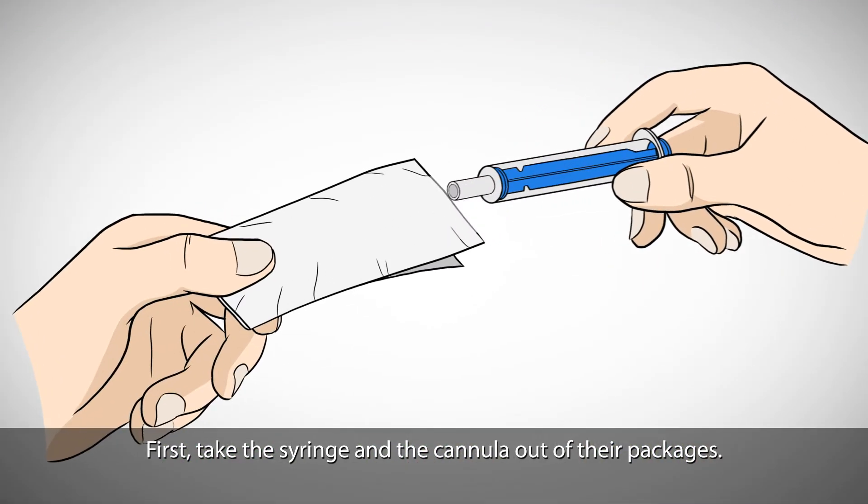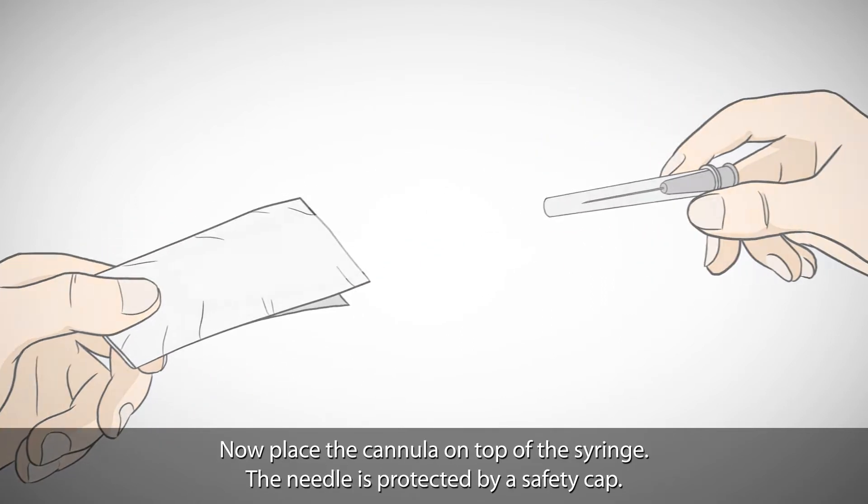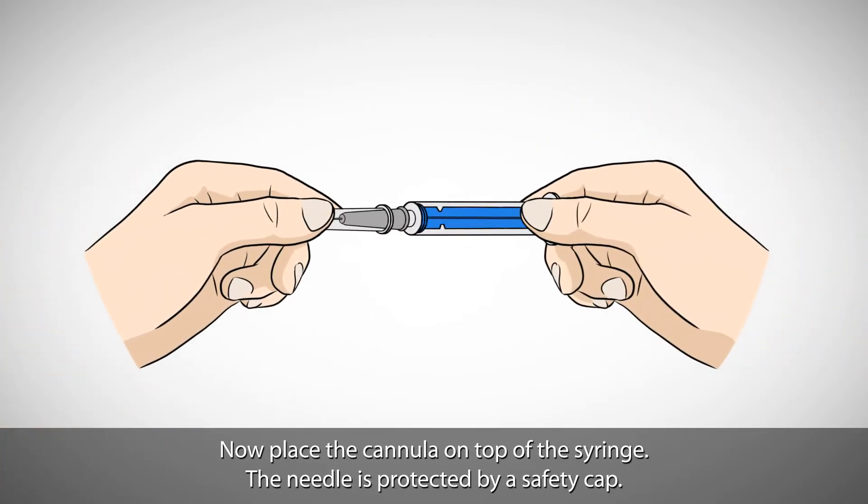First, take the syringe and the cannula out of their packages. Now, place the cannula on top of the syringe.